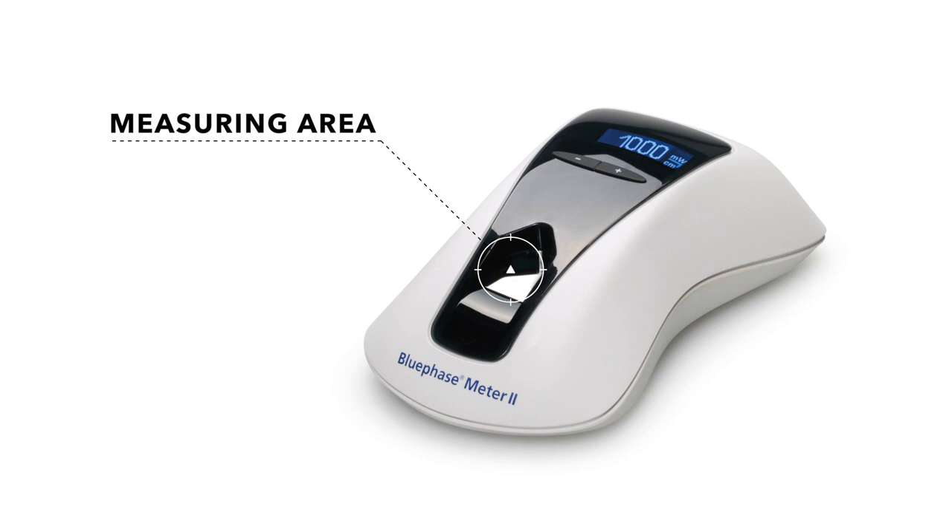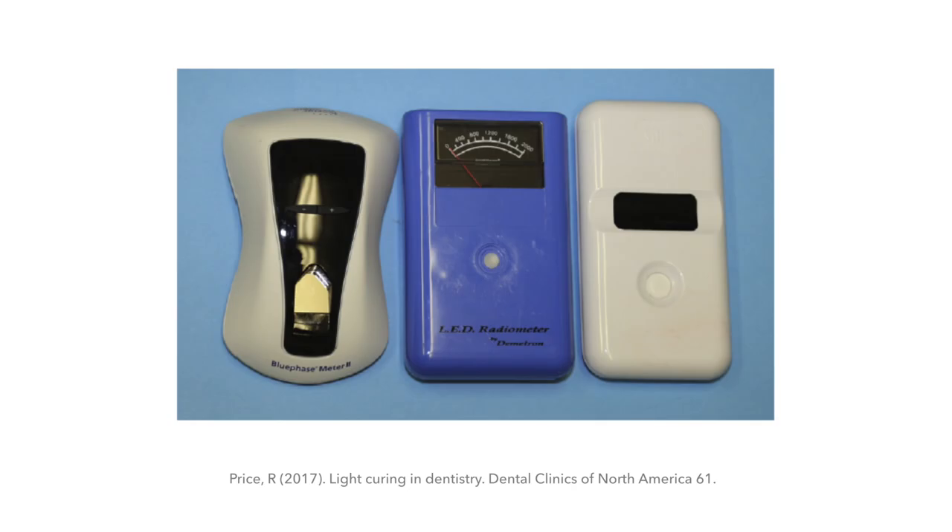It's important to have a dental radiometer in your office to measure light output on a regular basis so you understand how well your light is performing. When buying a radiometer, make sure it allows you to place the entire tip of your light onto it. For example, the Ivoclar Bluephase meter has a very large surface area for measuring, compared to some smaller radiometers whose small measurement area can lead to inaccuracies because they're only measuring part of the beam profile.